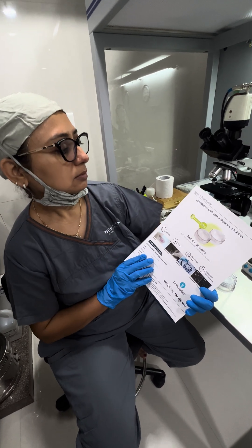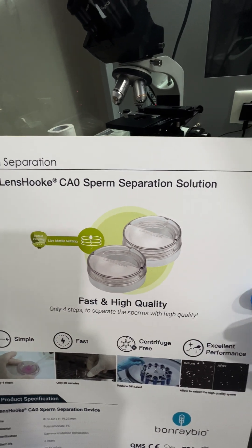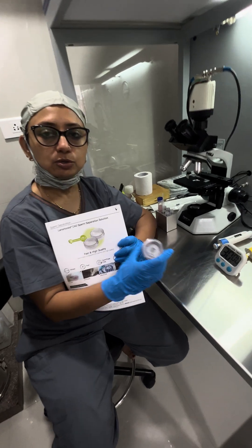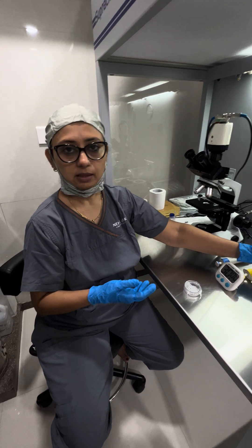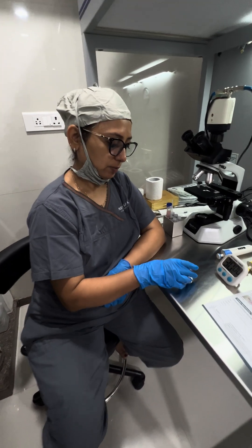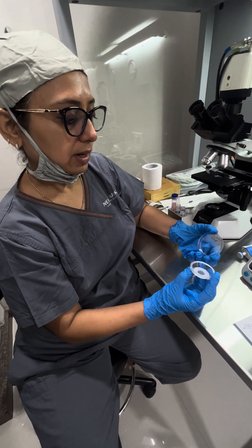Today we are doing a demo for Lansuk CA0 sperm separation solution. This is basically a plate which does the swim up for us. They say that it gives us low DFI sperms only — it can sort low DFI sperms after this process.